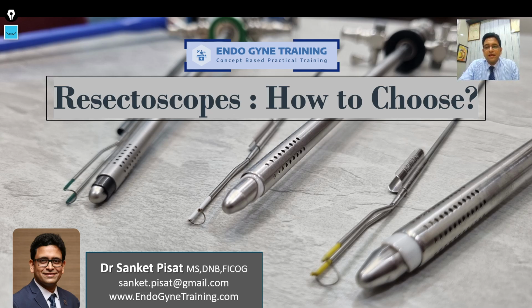In today's video we are going to be looking at various types of resectoscopes and how to choose between them. This is a very common question asked by postgraduates as well as practicing consultants, who are not able to make a decision of which resectoscope to use for which case in various types of hysteroscopic surgeries in gynecological endoscopy. So, the classification of resectoscopes needs to be understood properly if we are going to choose the proper resectoscope for our patient.